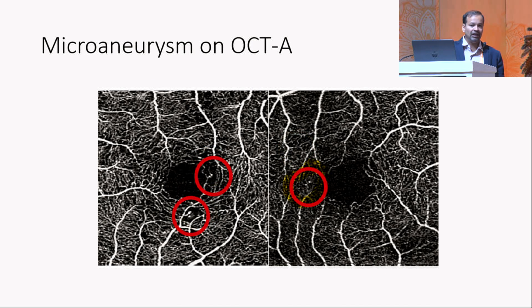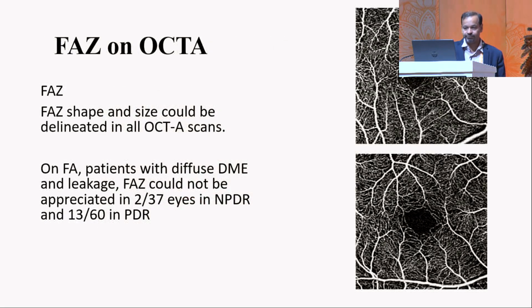Now traditionally we have not been doing FFA when there is no clinical diabetic retinopathy. If we do fluorescein angiography in these eyes, we might be able to detect these microaneurysms.